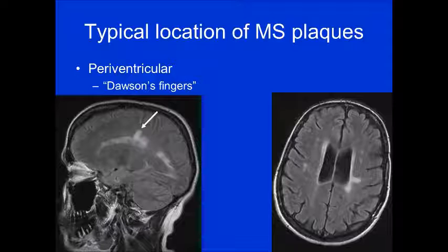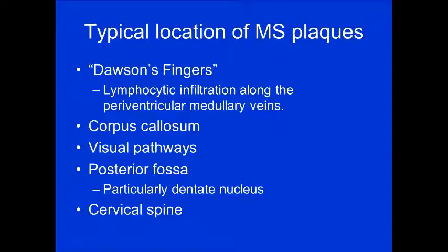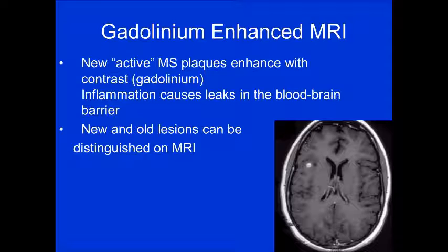You really have to look for areas typical for MS, and the most typical is periventricular Dawson's fingers. If your institution doesn't use sagittal FLAIR, talk to your program director — it's tremendously helpful when you're on the fence. Typical locations are periventricular along the periventricular medullary veins, the corpus callosum, along the visual pathways posteriorly, the posterior fossa particularly the dentate nucleus, and the cervical and thoracic spine.